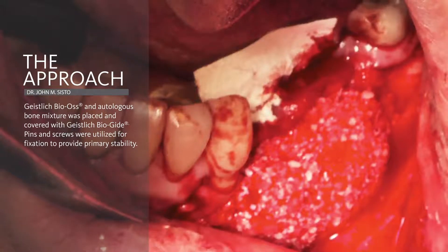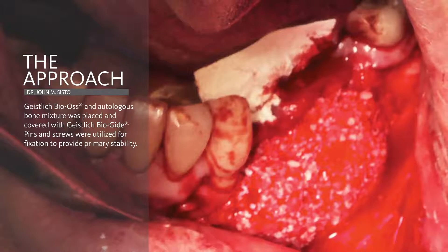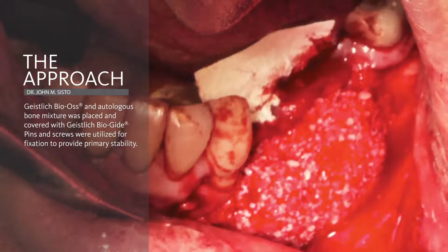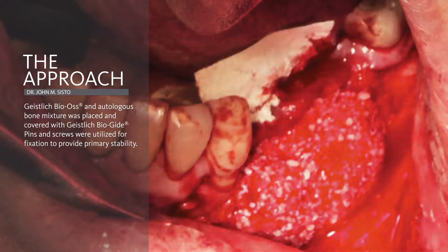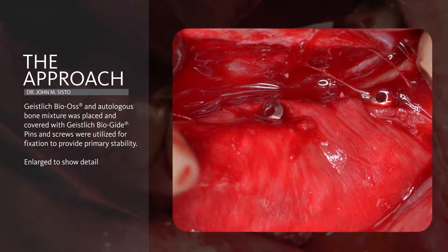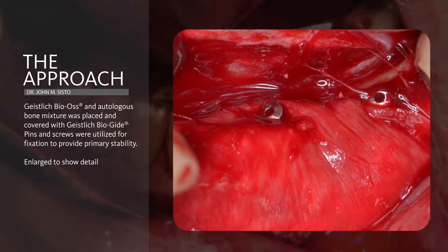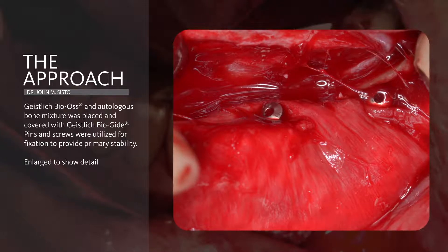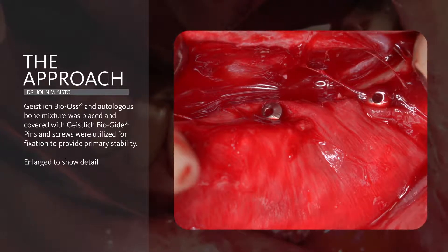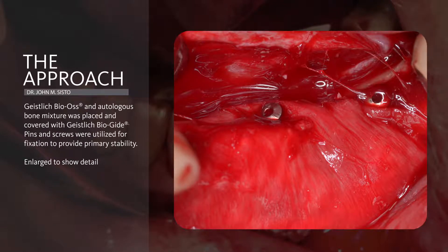A BioGuide collagen membrane is then placed over the graft site. It's held in place on the lingual with either pins or screws and then brought over onto the buccal surface, completely covering the graft. The immobility of the graft by the collagen membrane is key to graft survival and healing.